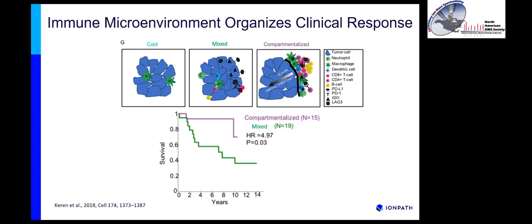And so this is really an example of not just knowing what the phenotypes of all of the cells are in a particular tissue sample, but that the spatial distribution and the spatial structure of those phenotypes within the sample is very important and can lead to prognostic information.